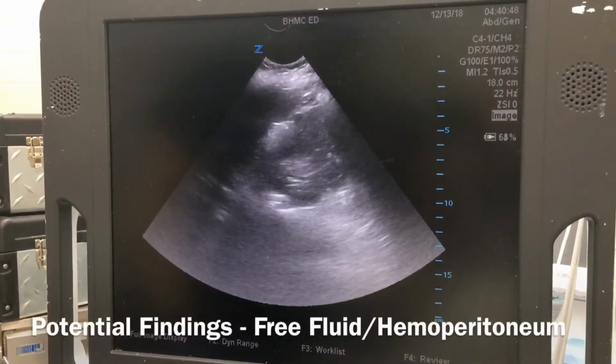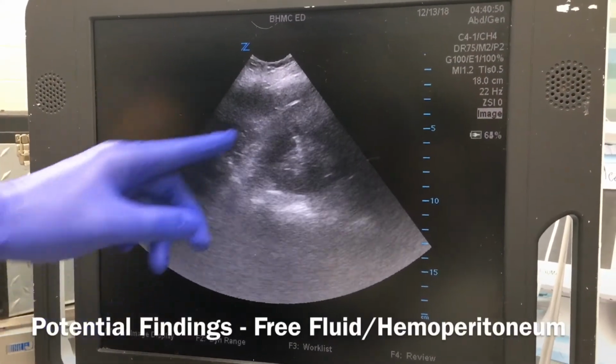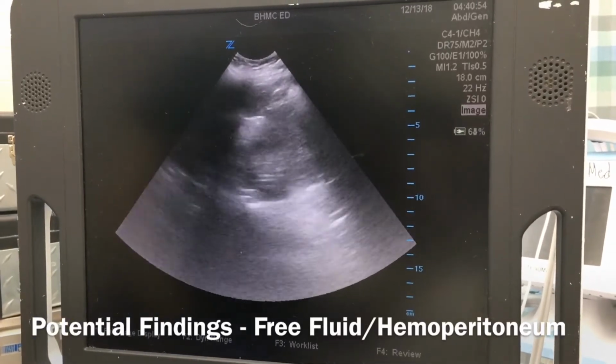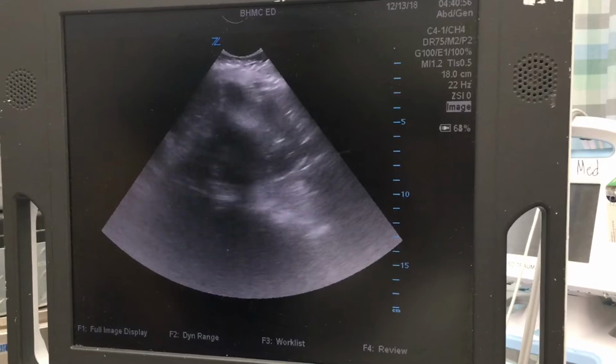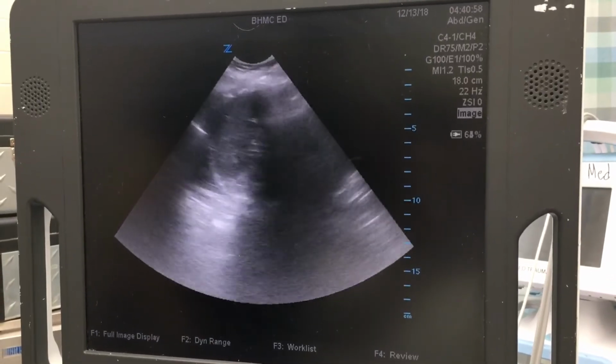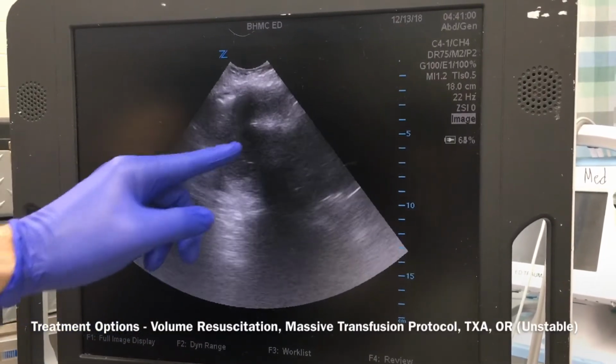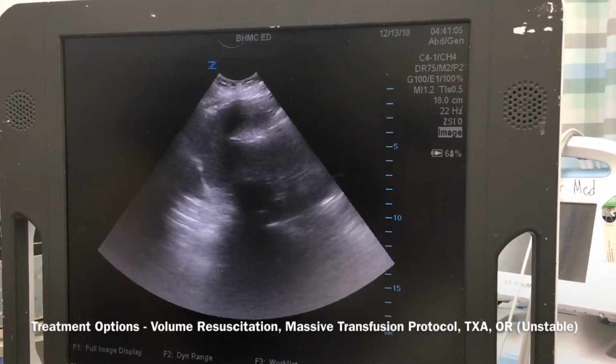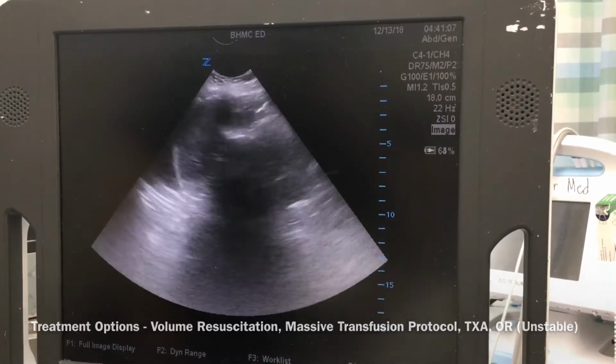So this is the view you want to get for the left upper quadrant. Again, we want to look for the interface between the spleen and the kidney, and you want to scan through, making sure you get the inferior pole of the kidney, and also what's more important is actually the interface between the diaphragm and the spleen, which is the most sensitive area on the left upper quadrant for free fluid.